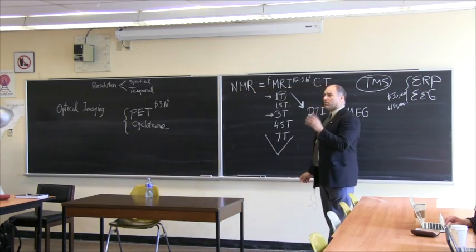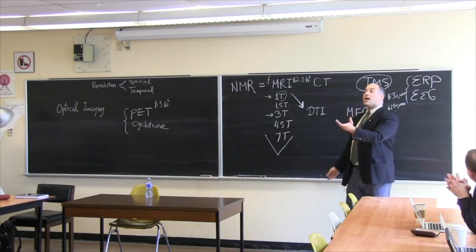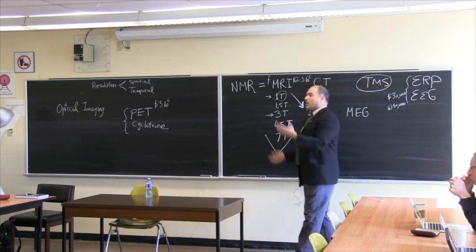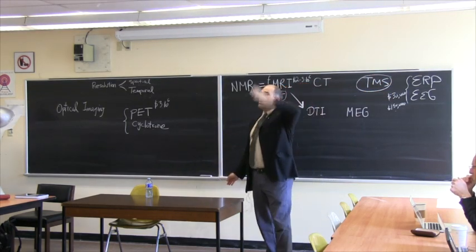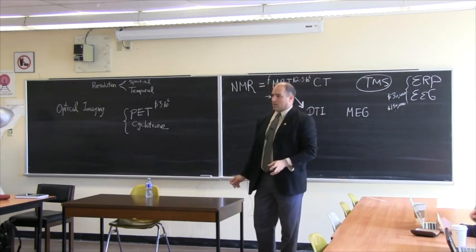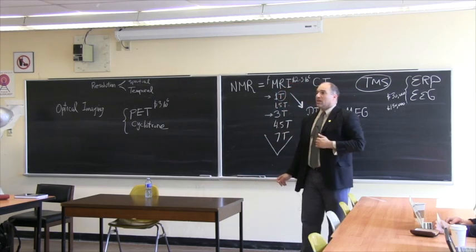It's very important to understand that MRIs are very different. By the way, today even MRIs are becoming more mobile. They're building trucks with big MRIs on them, and they park the truck in a place where there's no MRI, and they make announcements beforehand: on Tuesday we're going to have the MRI parked over there, and then all the people from the village come to get their brain scanned. This is getting more and more common.